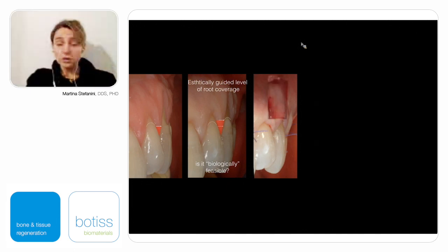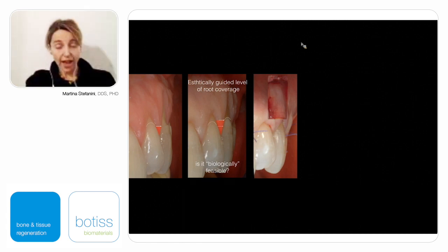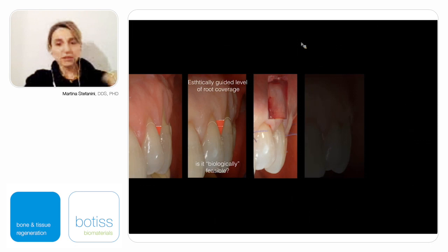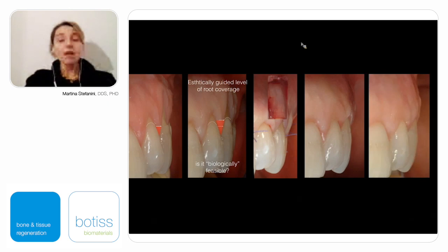And if we want to increase soft tissue thickness, and compensate the root abrasion, the concavity, in order to avoid the risk of flap collapse inside the root concavity, we can add a collagen matrix that will help the flap, will reduce the risk of flap collapse and will increase the thickness with time, as you can see, 1 year after the surgery and 3 years after the surgery, where you can see that the complete root coverage was achieved.